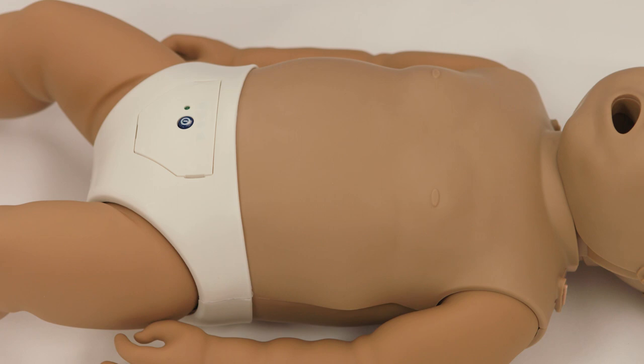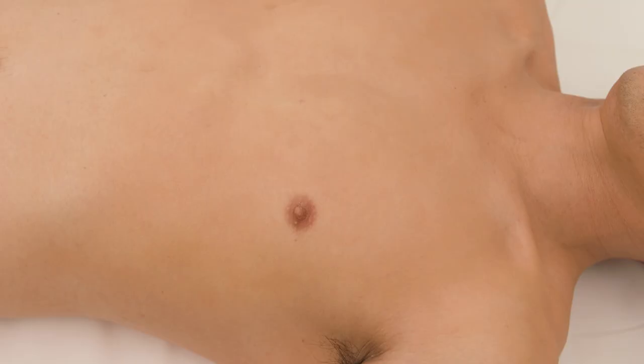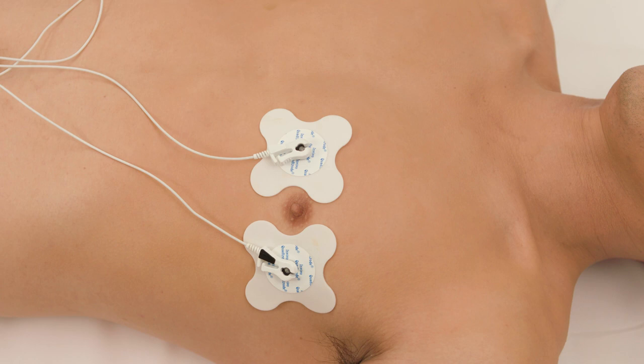When using the MR400 and the neonatal ECG electrode, the patch will be placed in the center of the chest. When using the MR200 and the multiple patch ECG electrodes, you will go to the imaginary nipple line on the left side of the chest and place one on each side of the nipple. Then place the other two below, on the lower half.